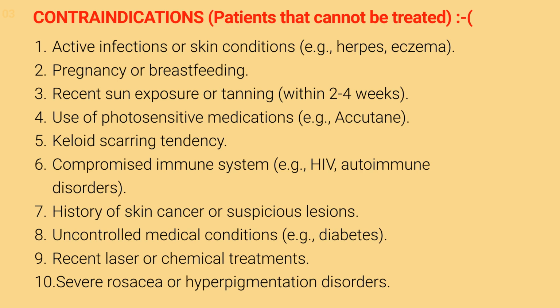Medications like Accutane, isotretinoin, antibiotics, or certain birth control pills can make the skin more sensitive to light and increase the risk of burns or adverse reactions. Patients prone to developing keloids, raised scars, should avoid aggressive treatments like ablative lasers, as it can increase the risk of scarring. Conditions like HIV, autoimmune disorders, or patients undergoing immunosuppressive treatments may have delayed healing and a higher risk of infection. Caution is advised in patients with a history of skin cancer or suspicious lesions in the treatment area.